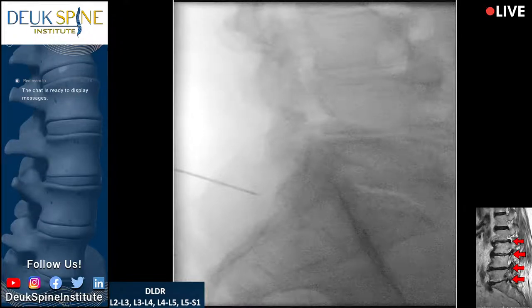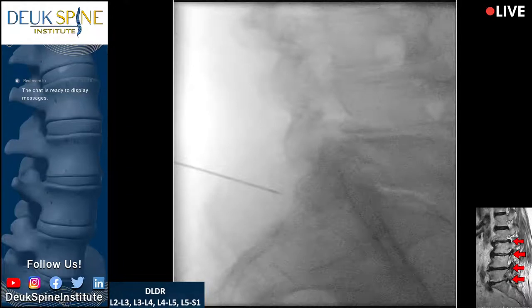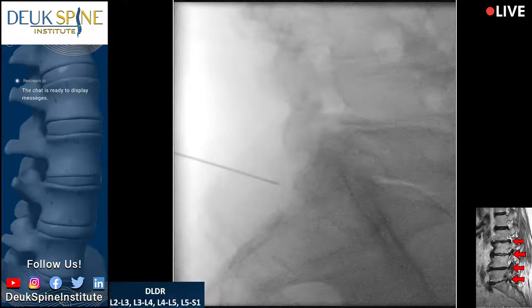Maybe we've gone past the midpoint. Go even further. Let's see what happens. Shot. Believe it or not, that looks more lined up, right? The facets do. Now I think we're off on wag a little bit. It's weird, because if you look at his facets at L5 on S1, the inferior facet of L5, they're actually lined up better now. But if you look at the back of the L5 vertebral body, it's off. So our facets are basically one bigger than the other. That's how you explain that, because the back of the L5 vertebral body cannot remodel that much. So let's go ahead and get the back of the L5. See if we can get back the alignment we had before, maybe a little better. It's more of an orbital issue than a wag issue.